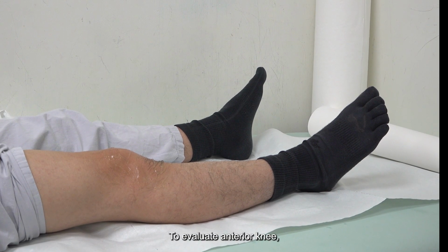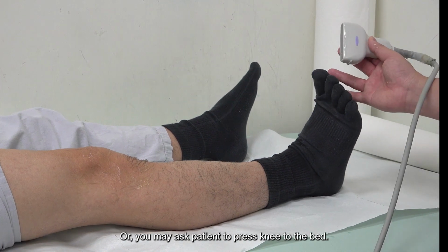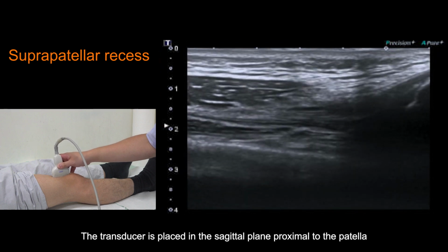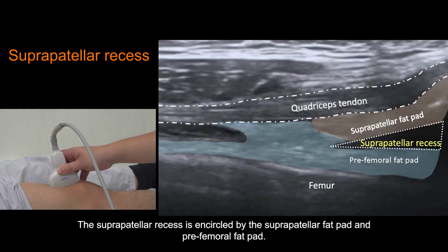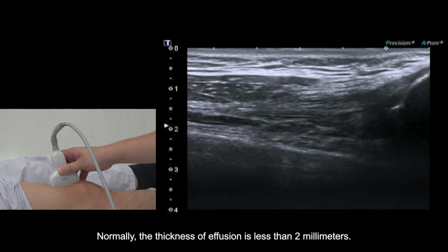To evaluate the anterior knee, we need the patient to lie down with knee extension and ankle dorsiflexion. Or you may ask the patient to press the knee to the bed. The transducer is placed in the sagittal plane proximal to the patella. You can see the suprapatellar recess. The suprapatellar recess is encircled by the suprapatellar fat pad and prefemoral fat pad. Normally, the thickness of effusion is less than 2 mm.